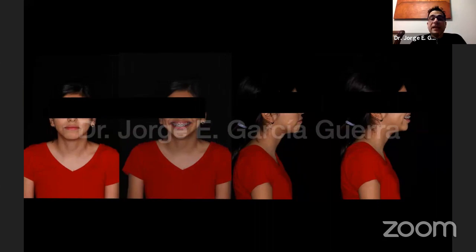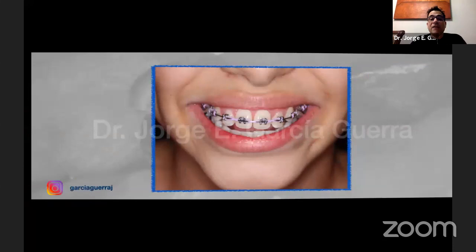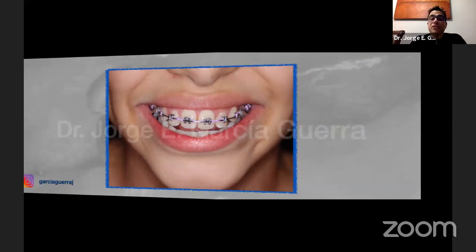Okay, now this is during the treatment. We were starting the retraction. You can see that we have a more improved profile. Now in this case, when we close spaces in our patients, we need to control the torque, or the position of the incisors.